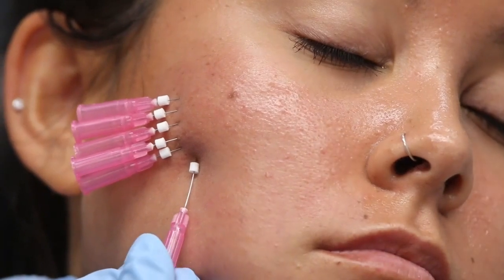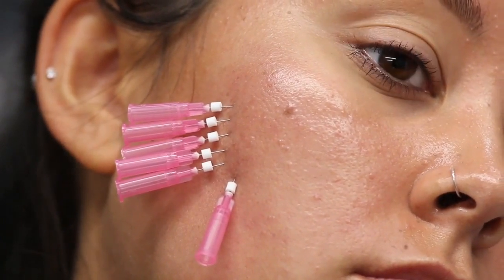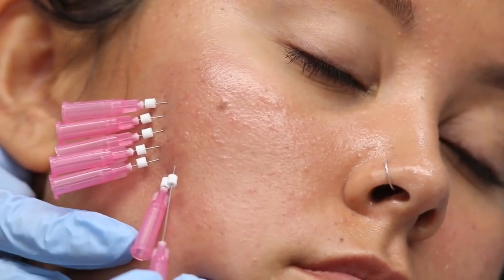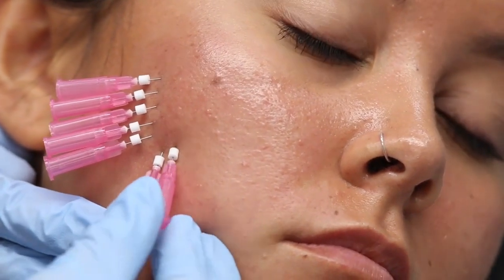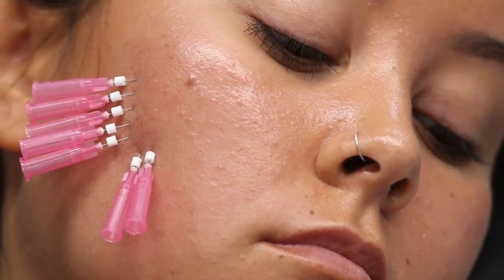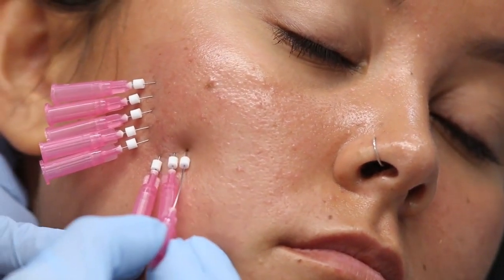We're going to, after this one, turn you just a little bit more. It may not be the best angle for Ashley, but it is the better angle for the camera. So Ashley has learned how to twist and turn herself. But part of the great technique in doing this is making sure that you, as the operator and clinician, are more comfortable with being able to access what you need to access here. But you're doing great. Hang in there, Nicole.